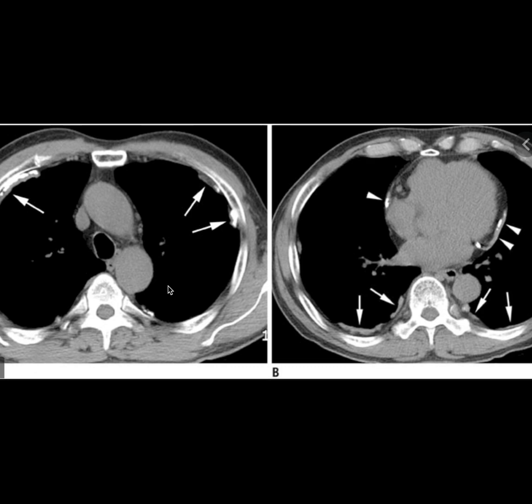Now moving on to how to identify pleural plaques. Plaques are obviously deposits — you can see here this is the normal pleura lining, but here you can see some abnormally deposited materials, which suggests pleural plaques. They are attached and near to the pleura. The major difference in identifying pleural effusion versus pleural plaques is: in pleural effusion the pleura will become hazy, and in pleural plaques you will see deposits near the pleura. Even here, you can notice these are the pleural plaques.